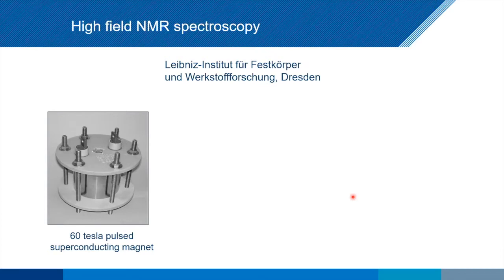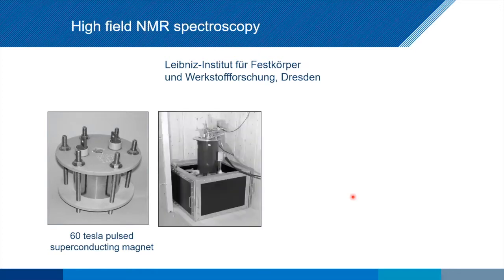The only problem is it's a pulse magnet. And that means essentially you put a lot of energy into this. It goes up to 60 Tesla and then it comes back down again. And it does that in about 20 milliseconds. So you take your magnet here, you put it in a large bath of liquid helium over here, and then we use a capacitive discharge to take that field from 0 up to 60 Tesla.